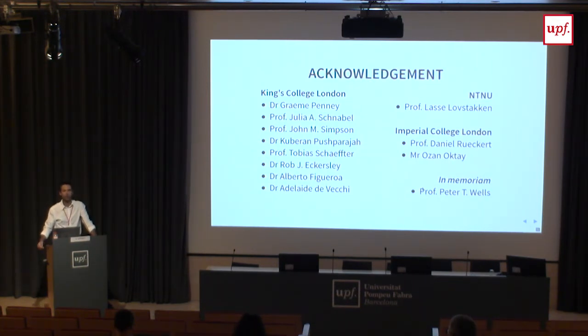But because we are constantly acquiring all the data during an hour or so, we end up with about 20, 30, 40 gigabytes of images for each patient. So it's 20 gigabytes of images, about 40,000 images for one patient. So 40,000 images is a lot of data. It's not data of a group or representing variability within a group, but it's for one specific patient. But it's something that normal ultrasound systems can do. So I think if you have a way of exploiting that from a machine learning perspective, that has a huge potential.